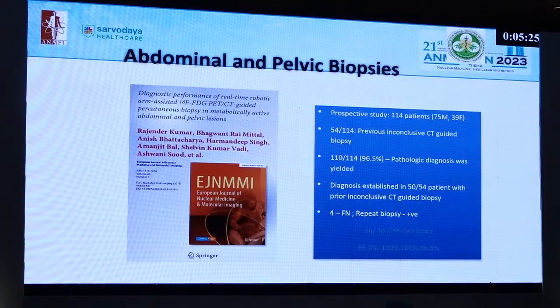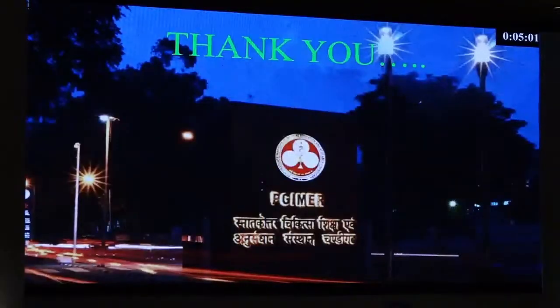And we have published our data in the European Journal of Nuclear Medicine, and we found that PET-CT guided biopsy is a highly practical approach for targeting abdominal and pelvic lesions. With PET-CT guided biopsy, a pathological diagnosis was established in 97% of the patients, and it is of utmost importance when the conventional biopsy is negative. PET-guided biopsy can be attempted. Thank you.